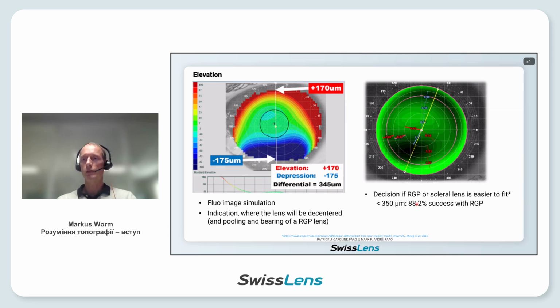When you are over this value, over 350 micron in the difference of the height, it's getting more difficult with an RGP lens, and the sclera lens might be the better choice. But in this example with 345, an RGP lens should still work quite well. And just to mention it, this elevation map can also show you the position of the apex of the keratoconus quite well and other things, but that no longer fits in the 25 minutes that I have.